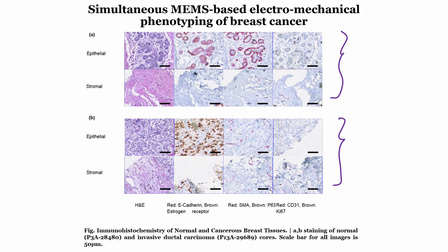These are gold standards, and the gold standard suffers from a lot of false positive and false negative results. And thus, we are trying to engineer devices such that these devices will not just rely on the gold standard, but also depending on the properties of the tissue, it will help the oncopathologist to make a decision whether a tissue obtained from a person is cancer or not, thus reducing false positive and false negative results. So, these are like a helping platform for an oncopathologist, the complete series that we are looking at. Okay.